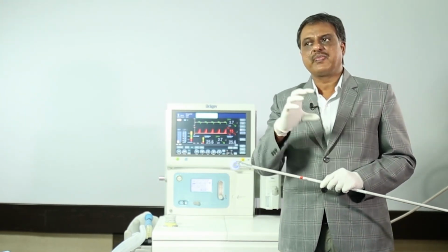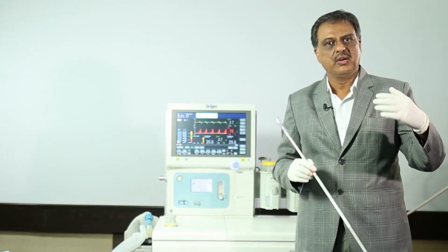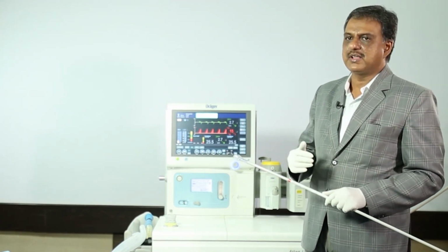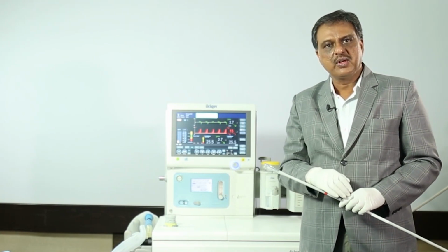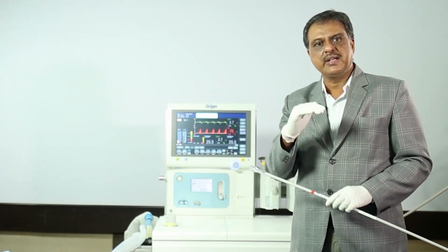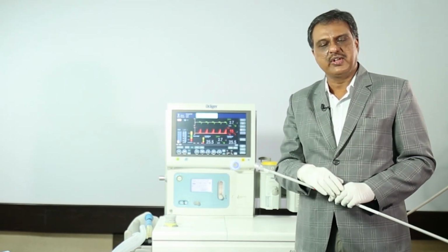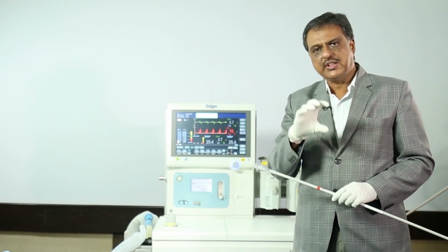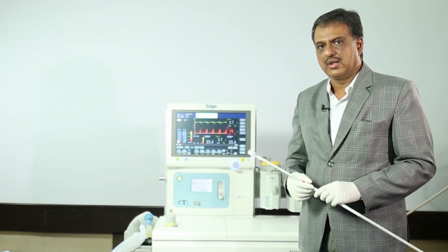Literature describes various methods of lung recruitment. One is vital capacity maneuver, second is vital capacity maneuver followed by PEEP, third is only PEEP, fourth is step-wise increase in inspiratory pressure and PEEP, and fifth is BiPAP and APRV. We are going to demonstrate each method in detail over the goat lung cadaver.